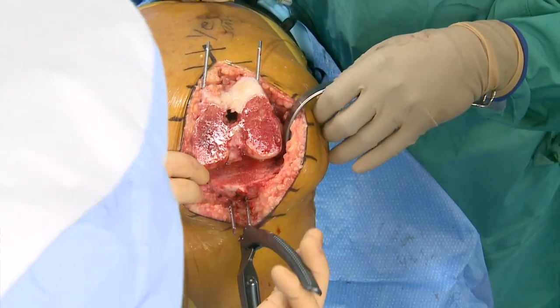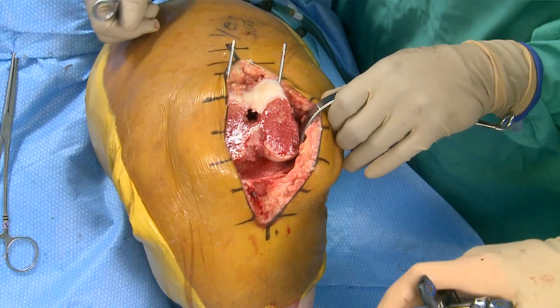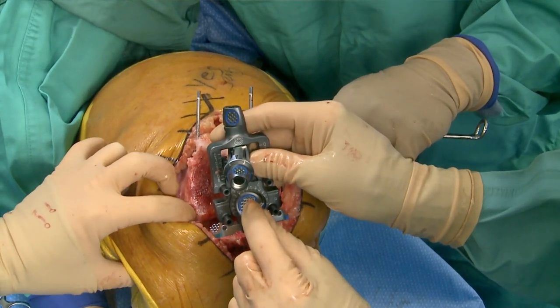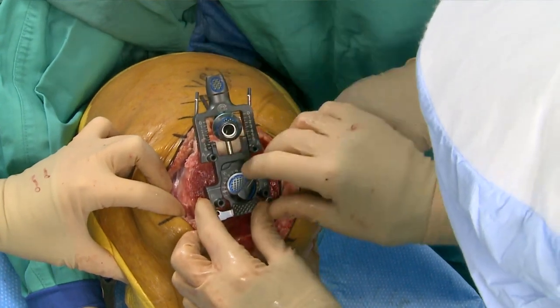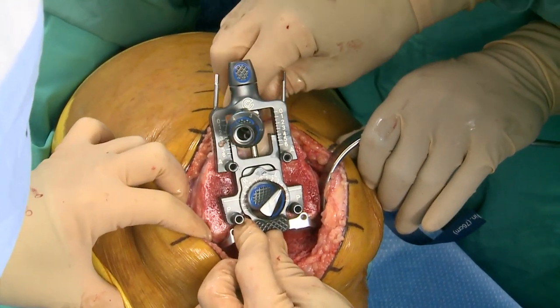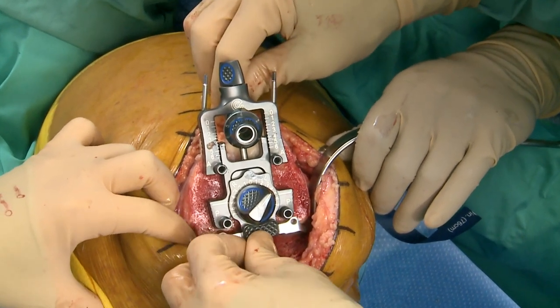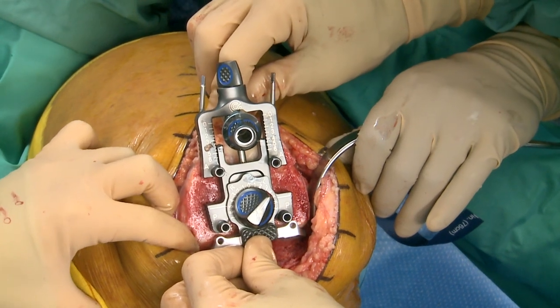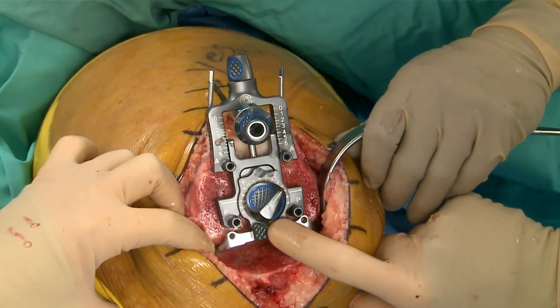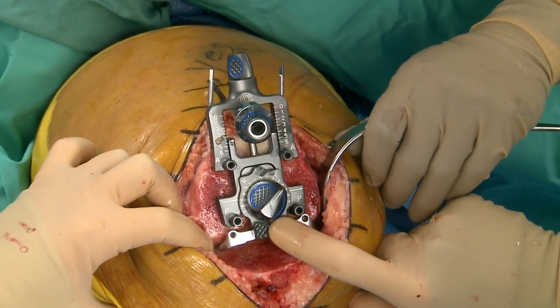We know we'll get the smallest insert in, so we know we're not re-cutting our tibia. We'll pull the tibial pins out but leave the femoral pins because I'm not sure yet about the size of my flexion gap relative to extension. Now we're going to size the femur. My default is three degrees from the posterior condylar axis, but I'm really not referencing anatomic landmarks for rotation. We're right on a size four, which means the two and a half tibia will probably go up to a three.